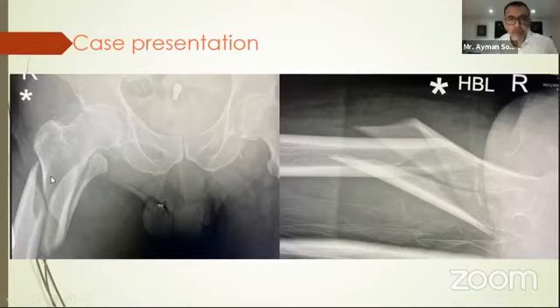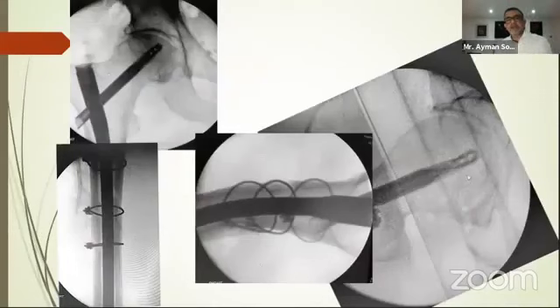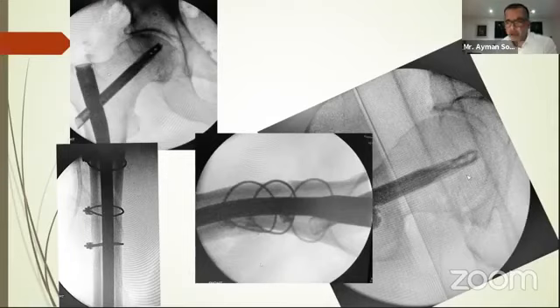The problem with the subtrochanteric fractures, you can't really see them on one screen of the image intensifier. So I've taken the liberty of collating the images together. So this is what I've done. I have corrected my deformity first. I've restored the tube. I've put a primary fixation with bone clamps. I've done my nail and then substituted the primary fixation for cable wires. Now this is what I believe is the way forward in these fractures. These are difficult fractures, and this is what you need to achieve. You need to achieve near anatomical reduction and stable fixation.